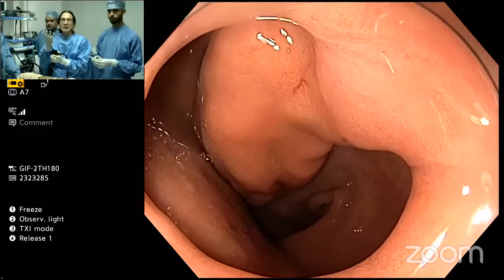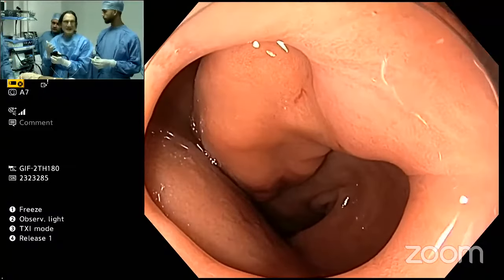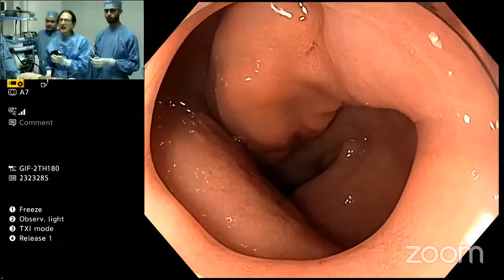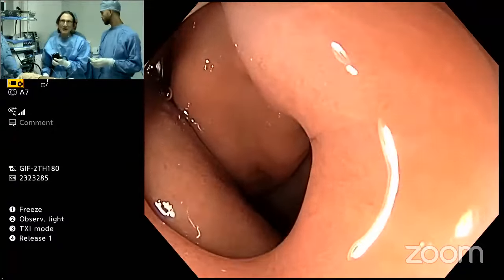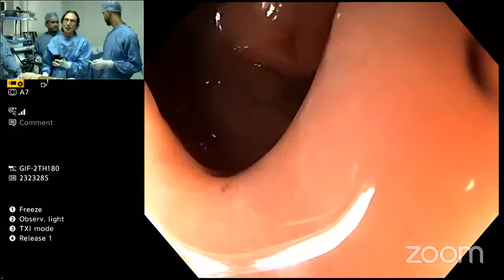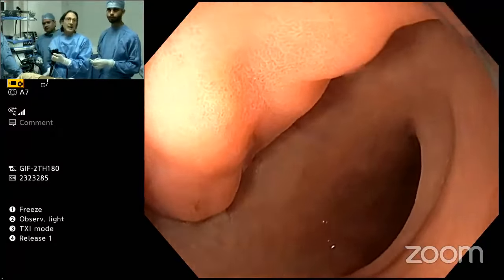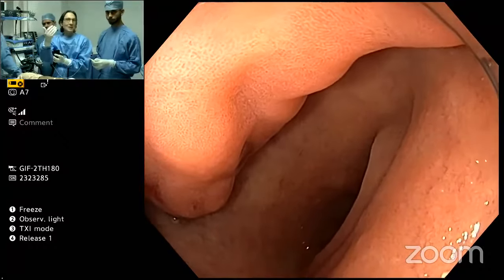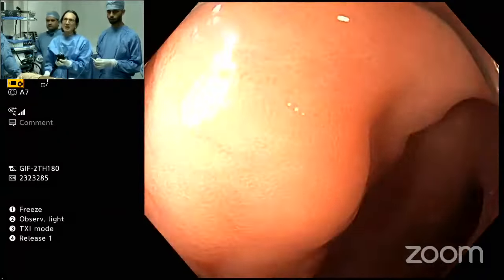Now, if it's an echogenic lesion, it looks like a lipoma, the only reason to remove it is if the patient's symptomatic, and this patient had a bleed. And these lipomas very often bleed. They can get very long. Look at this one. It's like a cigar in the bulb extending down to the second portion, but it probably also flips out into the antrum as well. It probably pendulates between both the duodenum and the antrum. So I think this is where the attachment is, the broad base.